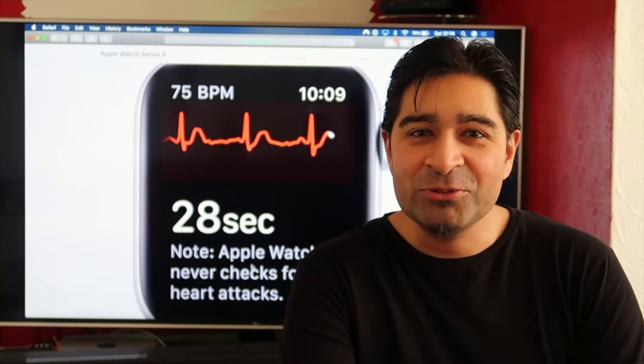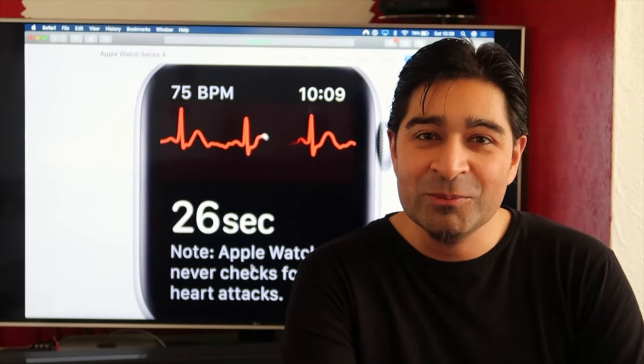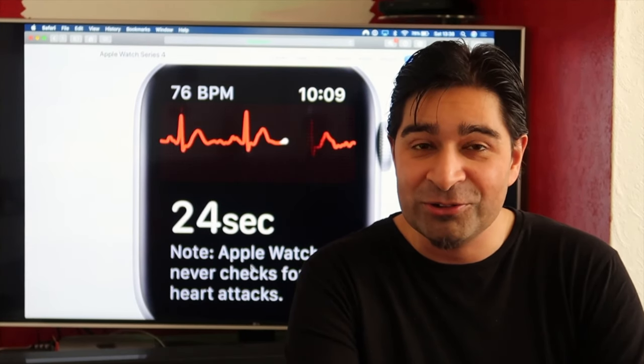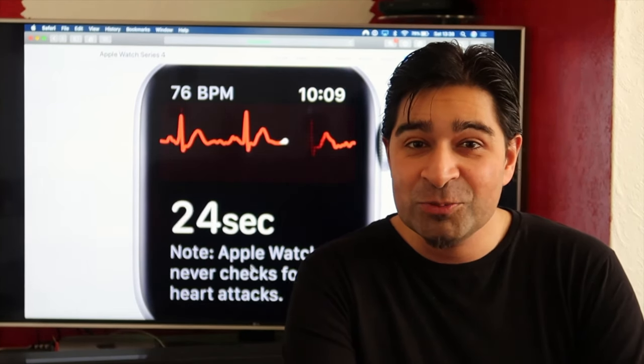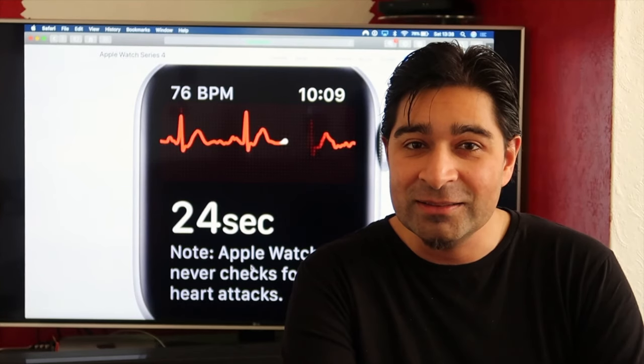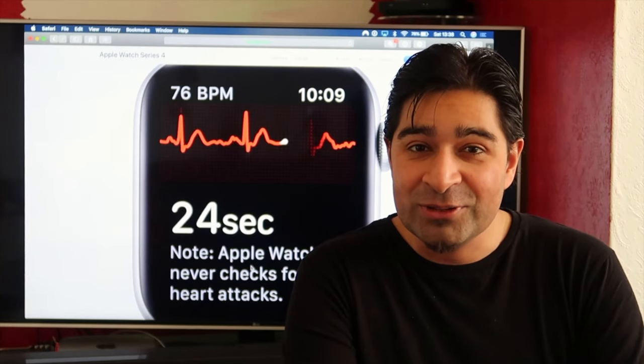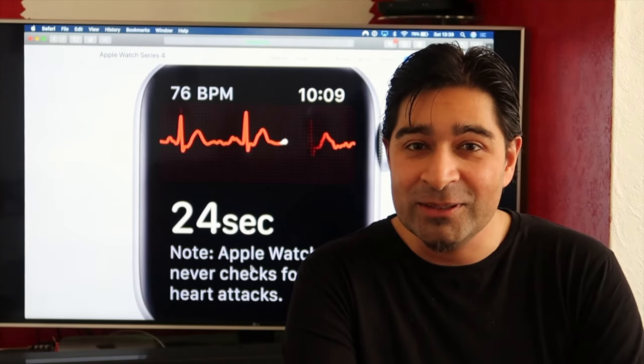Hi guys, welcome back to Persian Prince Vlogs. Today I'm going to be reviewing the ECG feature on the Apple Watch Series 4. It's only just been released in the UK with the latest version of watchOS, and I'm going to give it a try for the first time and see how it works, and if it works, and how well it works.